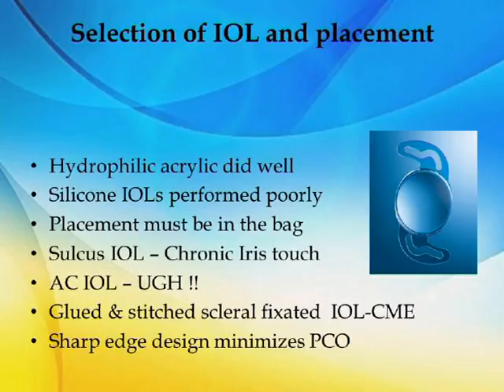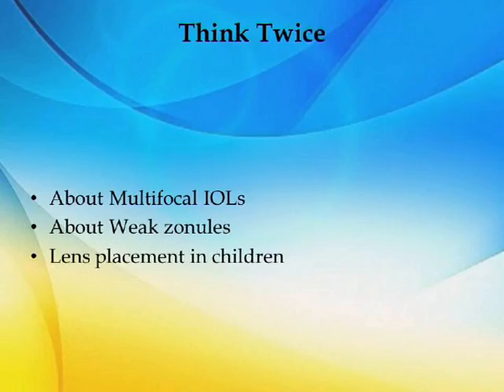The placement must always be in the bag. Sulcus IOL, we all know there is chronic iris touch, and this is a triggering factor again. AC IOL, better to avoid. Glued and stitched scleral fixated IOL, more prone to cause cystoid macular edema.